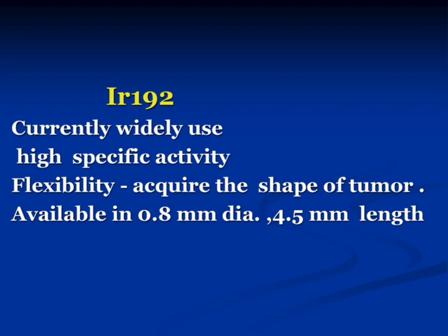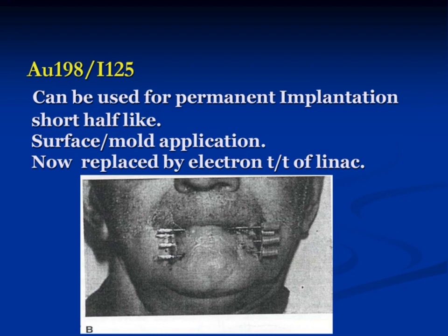The cesium is now not so popularly used, but in the form of needle, tube, beads after loading. Cobalt 60 source in brachytherapy is coming up, but it's not as good as the iridium because of high energy. The source is available in the form of needles, tubes, pellets, and iridium is available as wire, pins for manual after loading, and in the form of pellets for remote after loading. In the iridium, most departments have iridium brachytherapy. For carcinoma cervix treatment, having a pellets form for remote after loading brachytherapy.